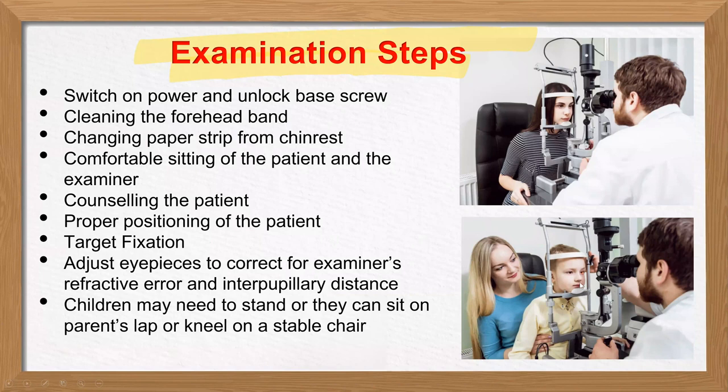And if there is a child, they can stand or they can sit on the parent's lap like this, or kneel on a stable chair. So we have three options for children. For examination of children, they can stand, sit on the parent's lap, or sit on a stable chair.